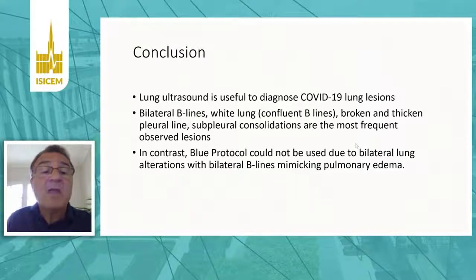But in contrast, if you use only the blue protocol with the A, B, A and B, and C profiles, so for us, due to the fact that most of the time we have bilateral B lines mimicking a pulmonary edema, it's not possible to use the blue protocol. And then for us, the blue protocol failed to help the clinician at the emergency room.